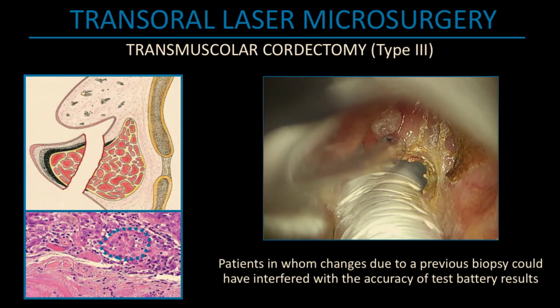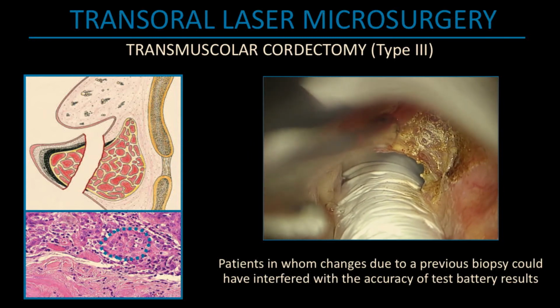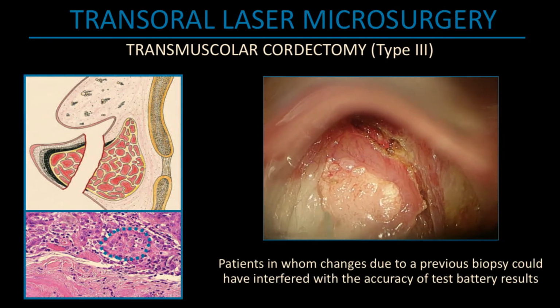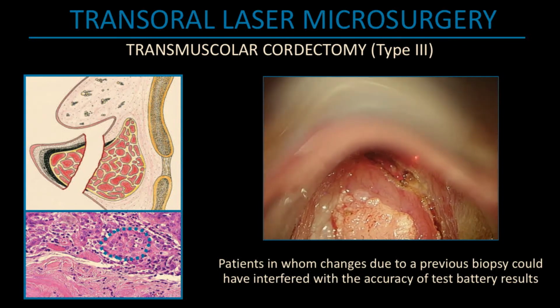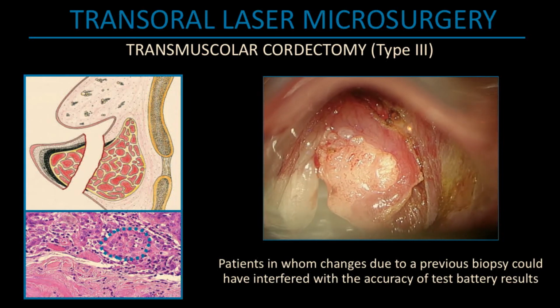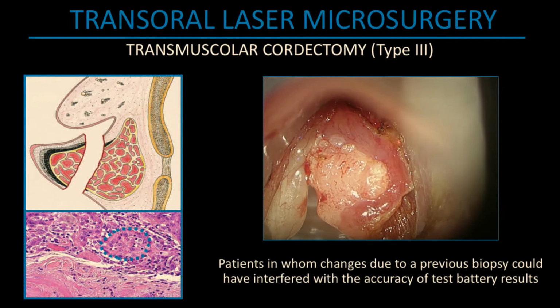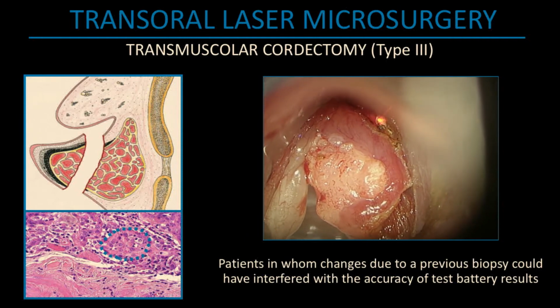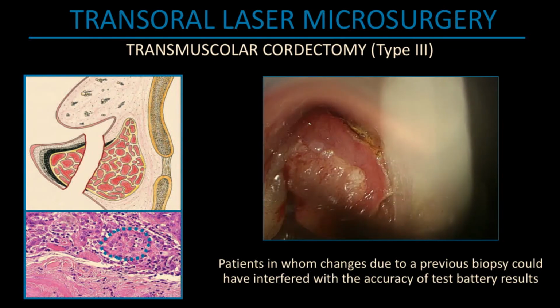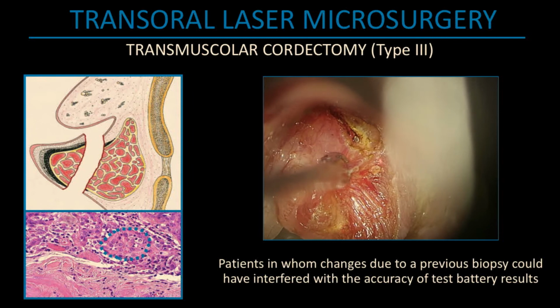Again, I performed ventriculectomy to better control the lateral extension of the lesion. This is very useful also during the follow-up, because if you remove the ventricle, the false cord, you can appreciate eventually some recurrence in the bottom of the ventricle. You can see a good margin, yeah? And you can obtain this just if you have a very good visualization of the ventricle. And of course, I have to remove some muscle.